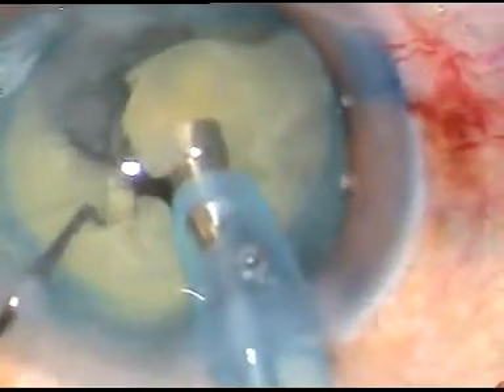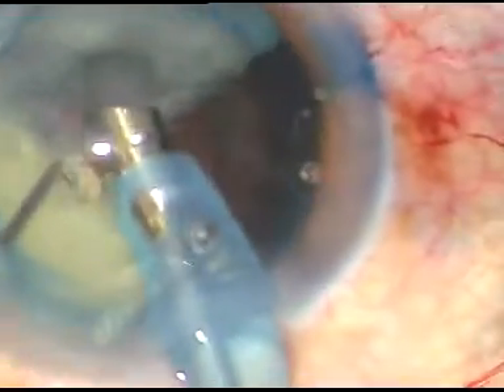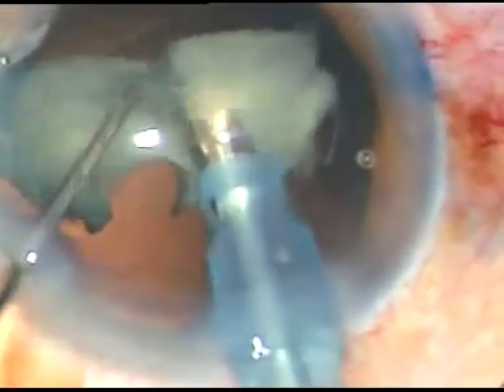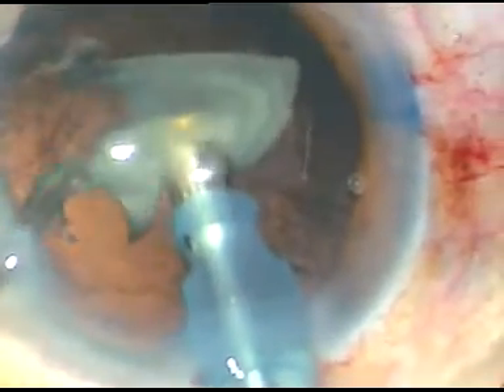This is the endonucleus being emulsified and taken out. At this time, the tip is turned towards the lens matter. If you turn towards the lens matter, followability of the lens matter increases dramatically, and in no time — in a few seconds or a few minutes — the job is done.